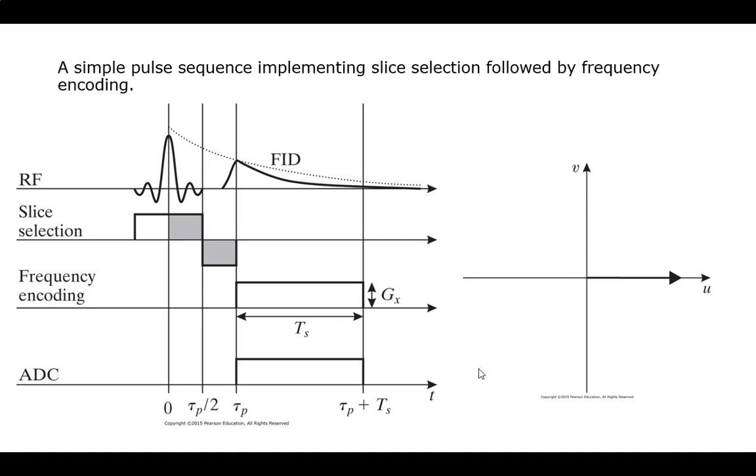Okay, so if we are doing an imaging mode, say T1, T2, or PD, if we needed to give it multiple kicks after a TR? Yeah, so this one, and we'll take a look at them, is the simplest one. This is your 90-degree kick. This is what just happens if I kick it and measure it. If you kick it and measure it, you walk down that axis of K-space or Fourier space, because it really is just Fourier space. We're about to go through the succeeding slides, and we'll show you how to measure in all kinds of other directions. Good? Awesome.